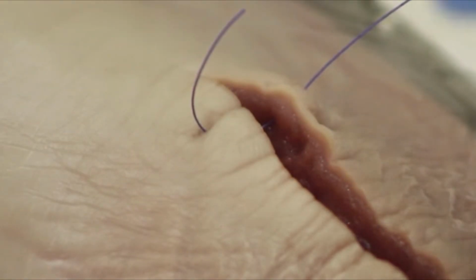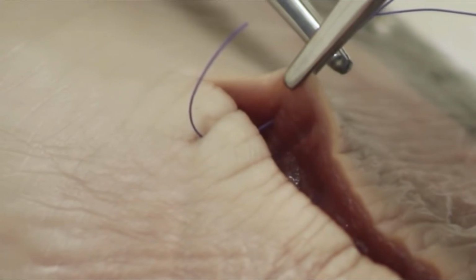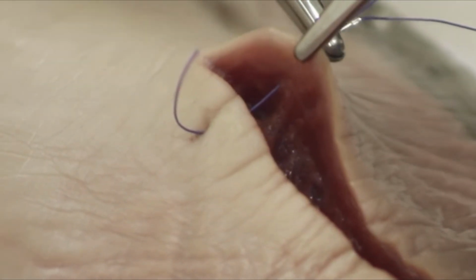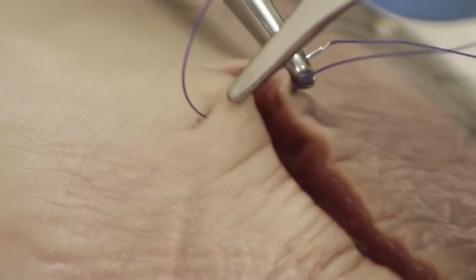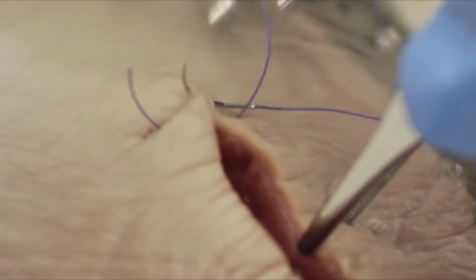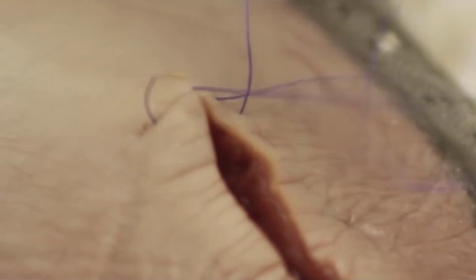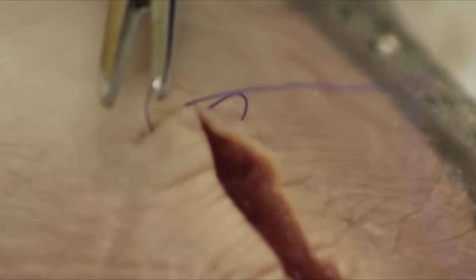On the same side, take a very superficial bite near the wound edge, just enough to capture dermis at the edge of the skin. Then, mirror that superficial bite on the opposite side. These two shallow bites should be symmetric in depth and distance from the cut edge. Make sure the throws stay in a line perpendicular to the wound. If the throws wander, the wound edges will approximate off-center. The suture needle and the suture tail should end up on the same side of the wound.